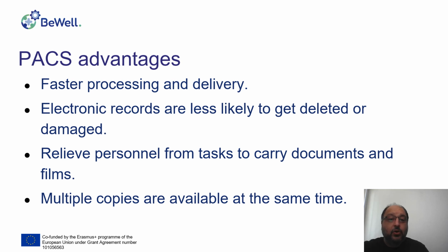Also, the electronic records are less likely to be damaged or deleted. Of course, this may happen either on purpose or accidentally, but it is less likely to happen with the electronic records. And they relieve the personnel from the task to carry documents and the films and to search for them. This is very time saving. Also, multiple copies can be available at the same time.